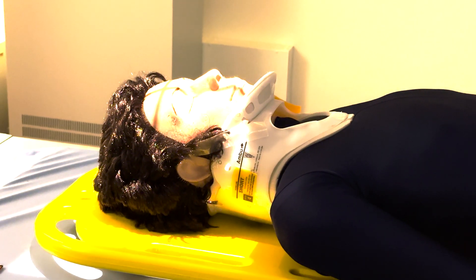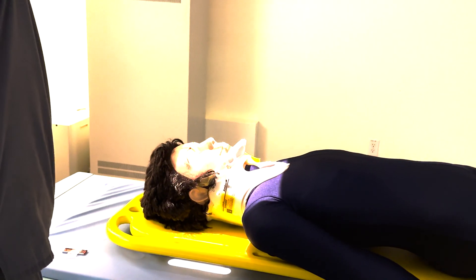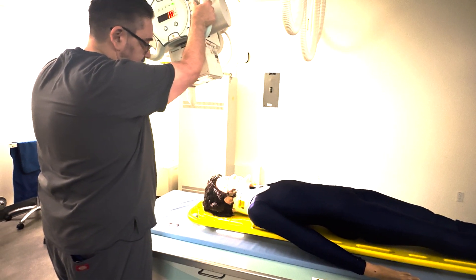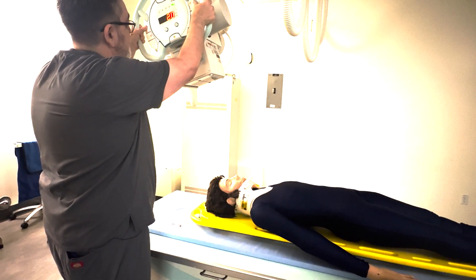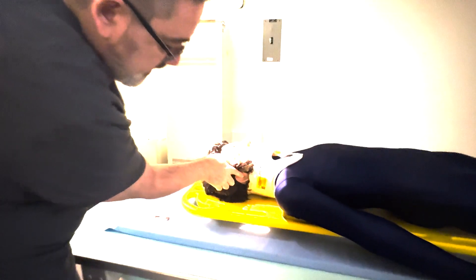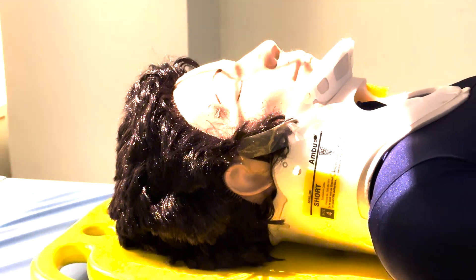That's all we're doing. I'm going to do the angle and the longitudinal lock at the same time, looking at that crosshair to hopefully align it to the OML. There on the outer edge — there's the EAM. It looks pretty good there to me.